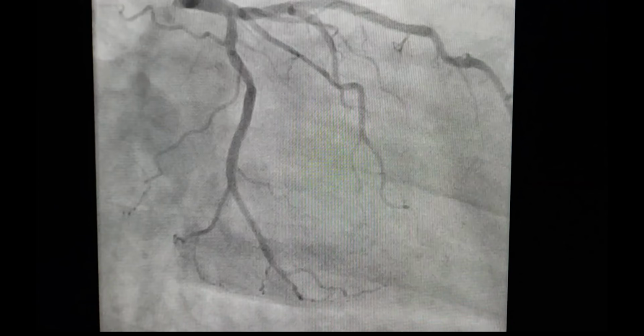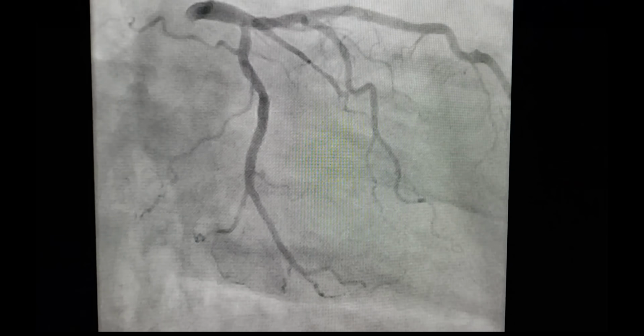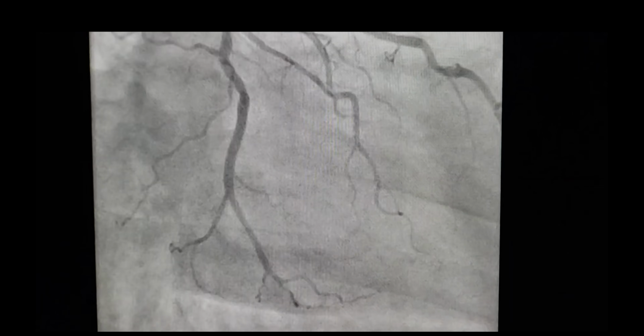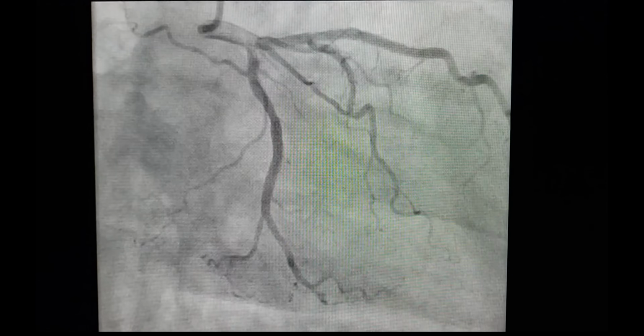All right, so today we're going to go over some cardiac cath cases. The first one is a little bit more normal, and then the other one has some anomalies on it that I want you guys to see if you can figure out. So here, usually I start my cardiac cath cases in the LAO cranial view, like I said, and then I kind of go four corners and I get more views if I need them. So take a look at this very first projection here.